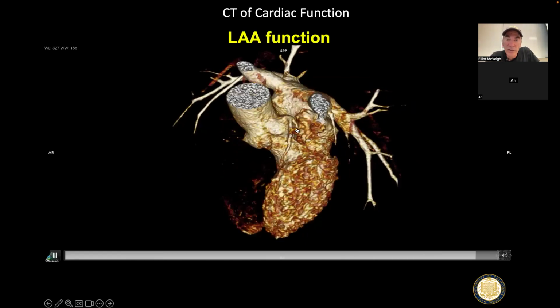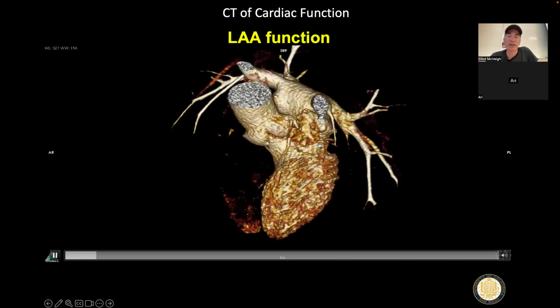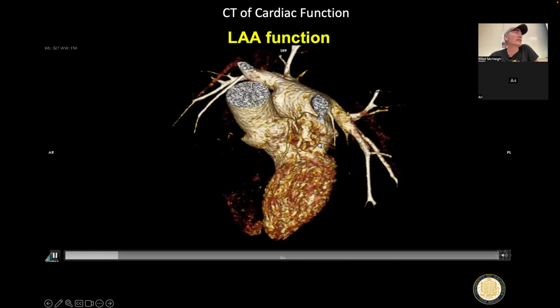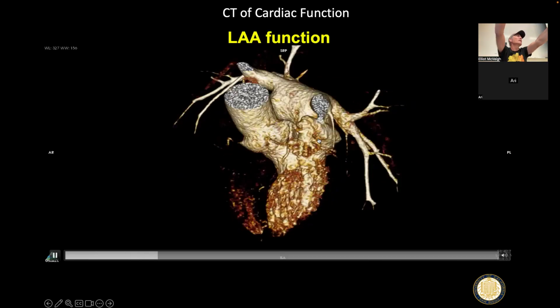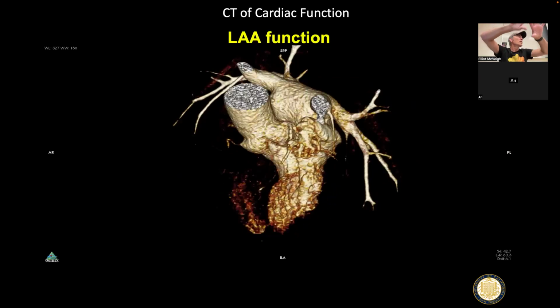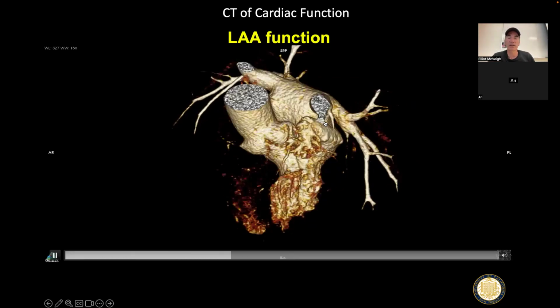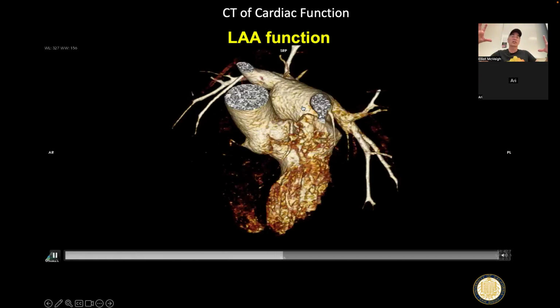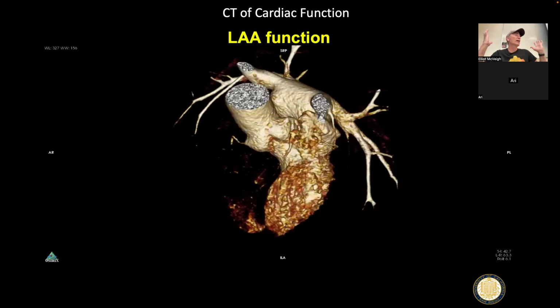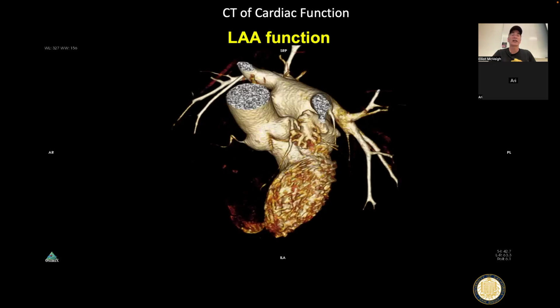But the interesting thing in this movie is this is the left atrial appendage. It's a weird looking little pocket, right? It's got all of these little rivulets going down into a distal complex structure, right? In this patient, they're not in atrial fibrillation. That motion, that contraction there shows that they have coherent atrial contractions. So they're not in atrial fibrillation. They're not at high risk.